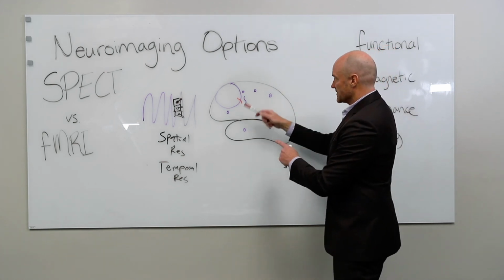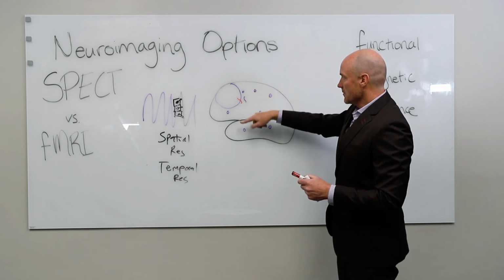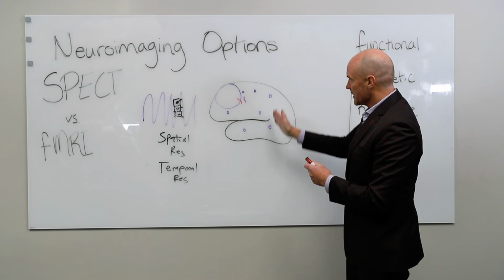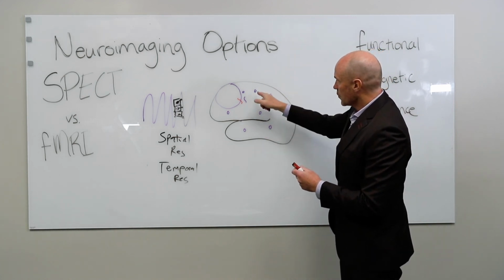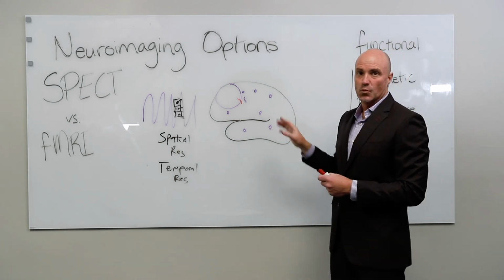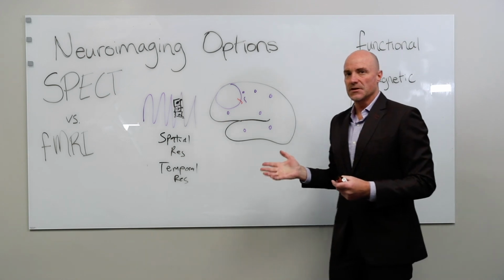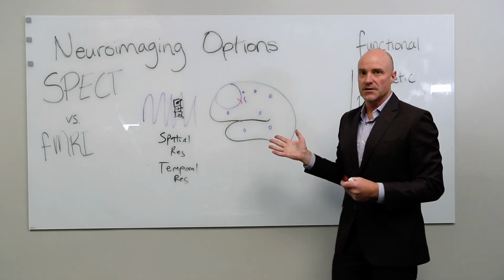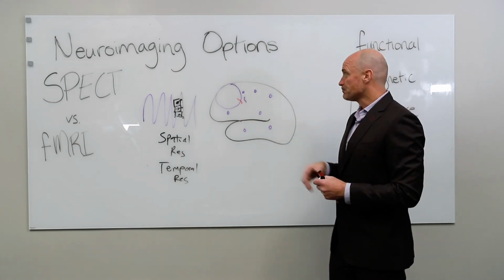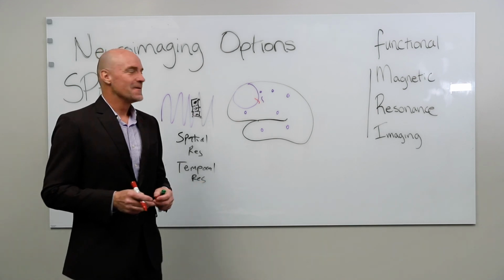They're passing around bits of information, but they're doing so on the course of second by second. So you can go through and image the brain and determine when activation was happening at each point, not just where that activation was happening. And that's key to how we do assessment in functional MRI for the application of concussion pathology. Let's turn back to concussion, all right?